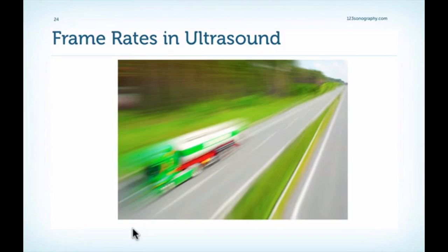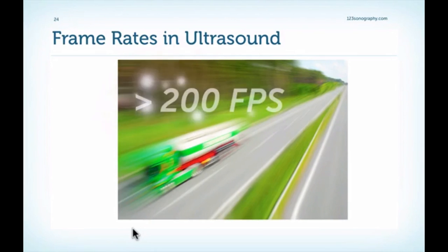And what can we achieve with echocardiography? Well, frame rates above 200 frames per second, and with experimental ultrasound even more, probably above 2000 frames per second. But the question remains, why do we need such high frame rates in the first place? They're higher or quicker than what our eye is able to grasp. Well, Marion is going to show you now in a demo what it is good for in ultrasound.